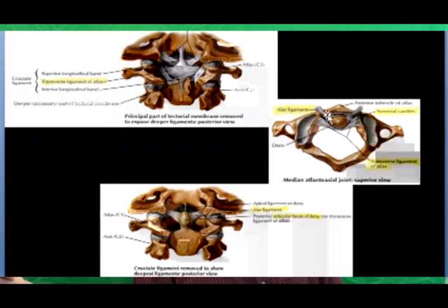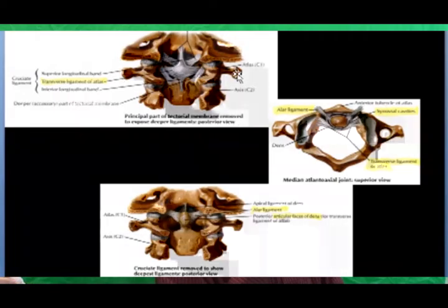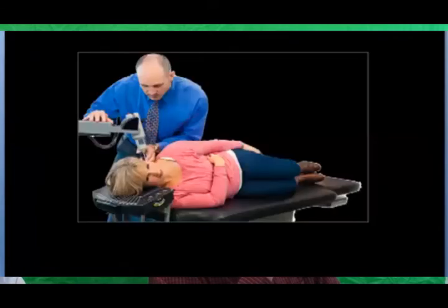But the thing to recognize is you have these transverse processes, this transverse process sticking out on the left, and this transverse process sticking out on the right. And if you use this AO technology, which I'll show you a picture of that Dr. Rosa does all the time, you can tap on that and put it back into its necessary orientation. So here's the technology right here.